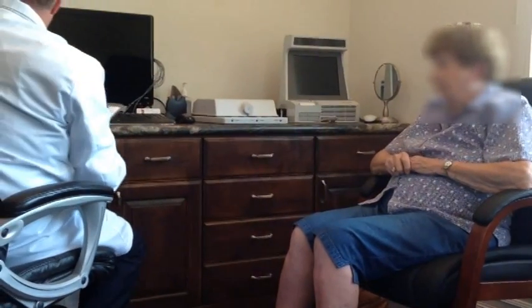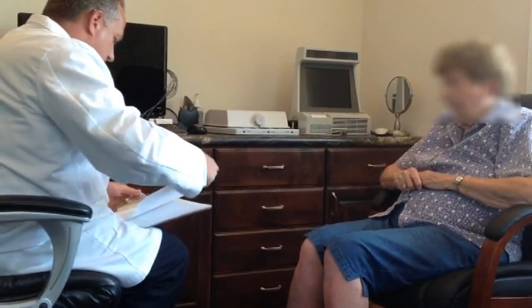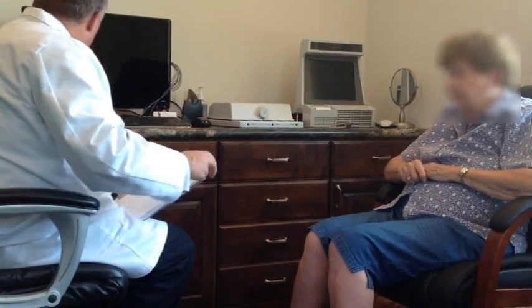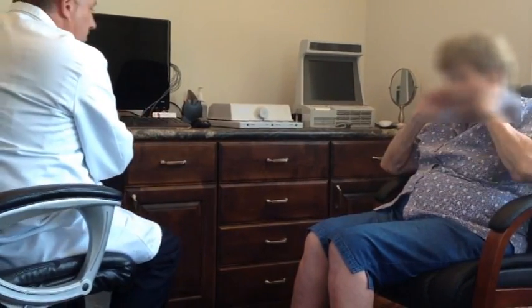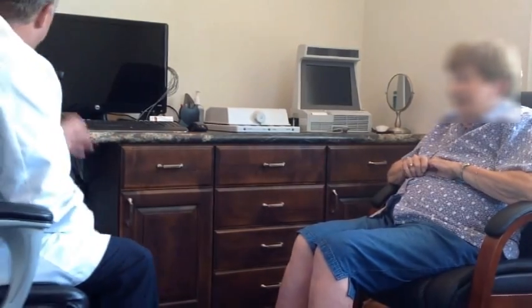Since you've never had your hearing tested before, let me explain a little bit about what we'll do. First thing, I'll start off by looking in your ears. I'll use our otoscope. I won't find anything there that surprises me. After I make sure everything's clear and there's no wax buildup or anything, we'll use this machine right here.